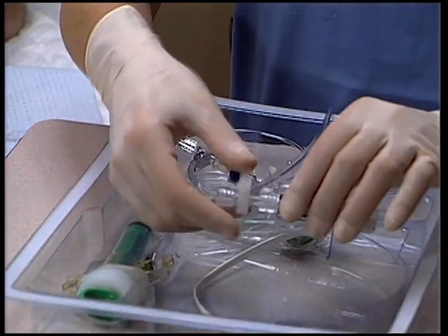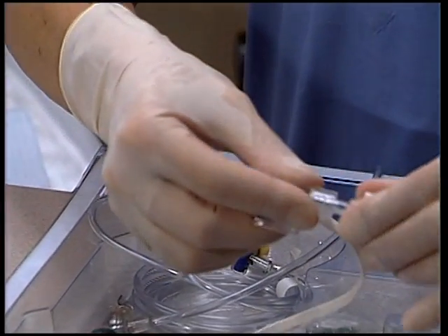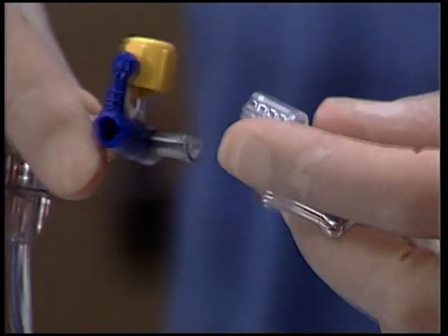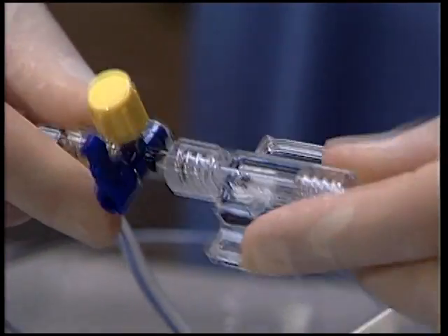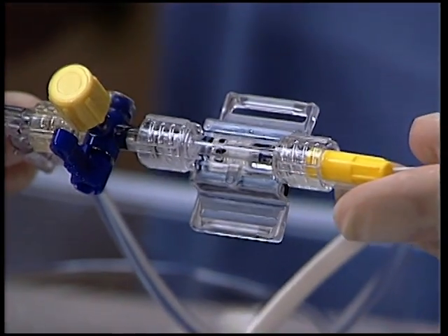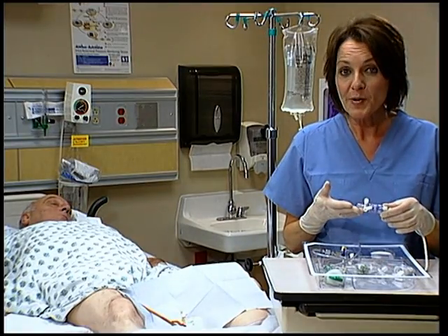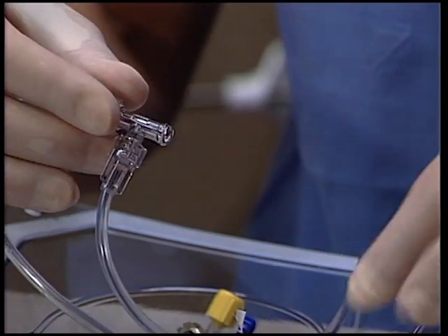Now, with sterile gloves, remove all attachments from the transducer. You may leave the flush device in place or remove it — the AbVisor will function either way. Connect the transducer to the stopcock and position it so the transducer is upright with the stopcock, then cap the transducer. Check that all connections are snug on the T-connector. If your transducer has a non-removable stopcock and flush device, be sure to remove the AbVisor stopcock and connect the transducer stopcock directly to the T-connector.